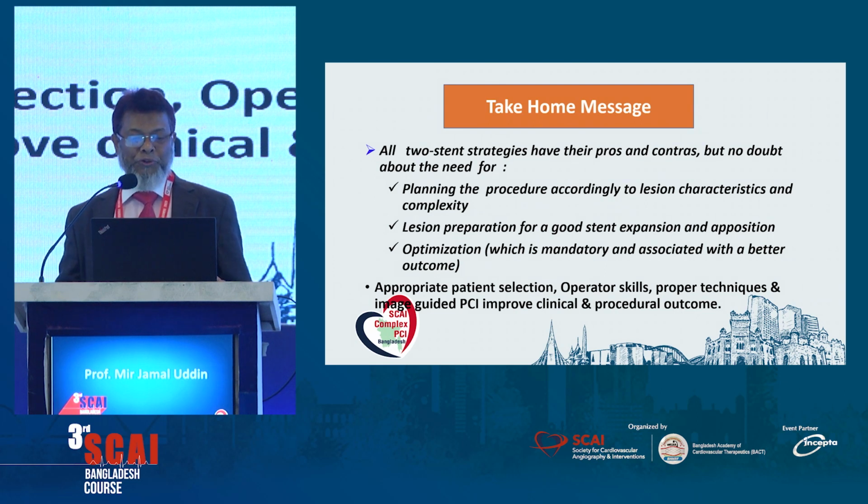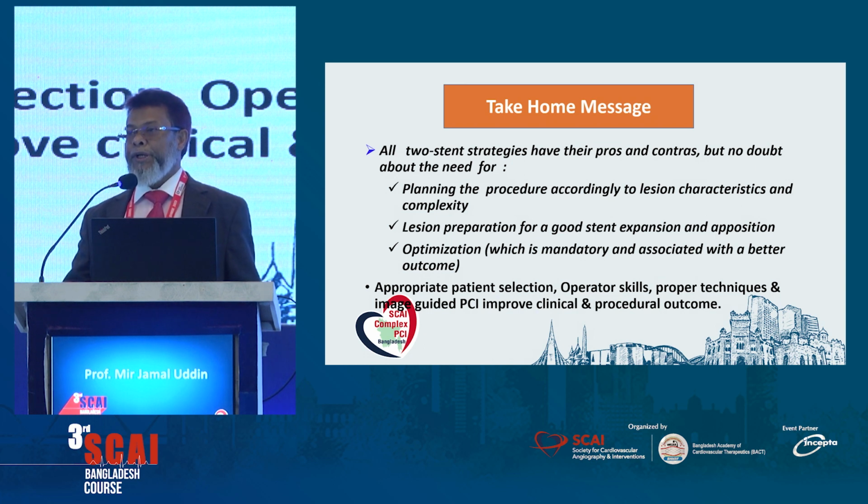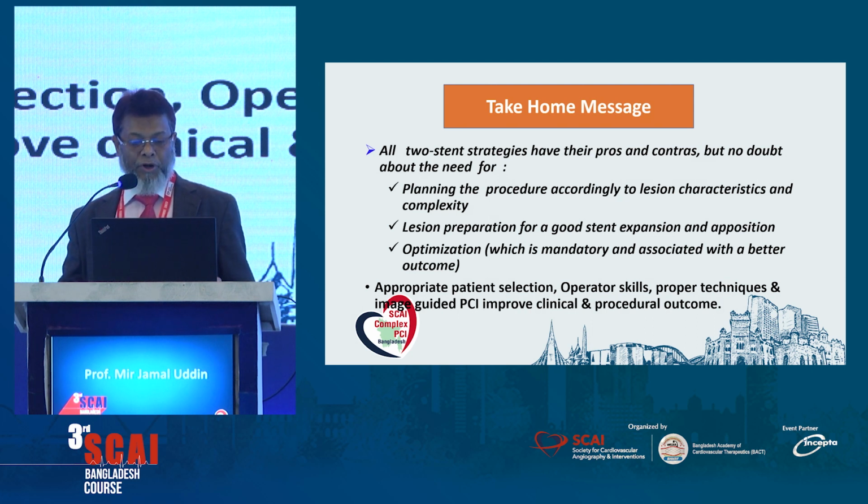Then my take-home message: all two-stent strategies have their pros and cons, but no doubt about the need for planning the procedure according to the lesion characteristics and complexity, lesion preparation for a good stent expansion and apposition, and optimization, which is mandatory and associated with a better outcome, preferably evidenced by intravascular ultrasound or optical coherence tomography.